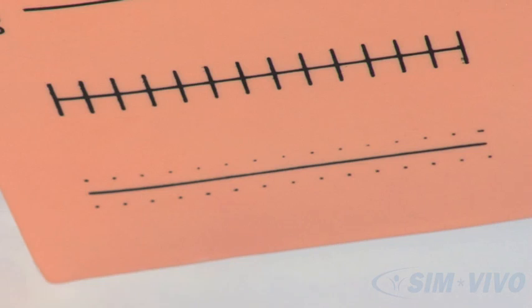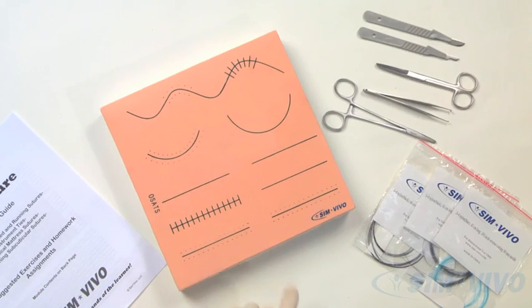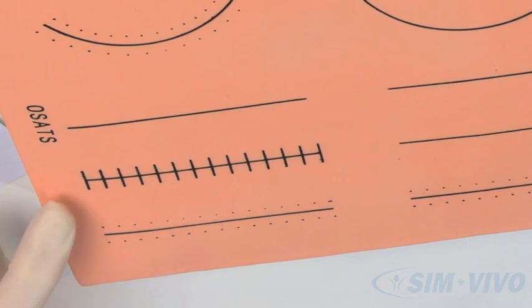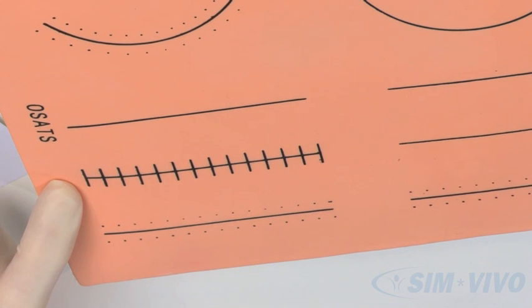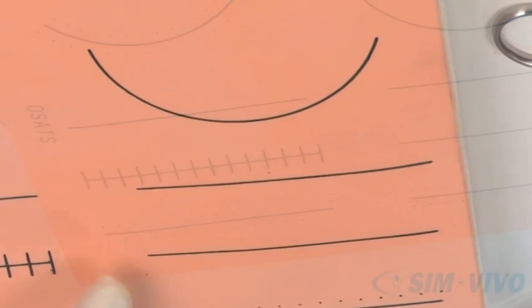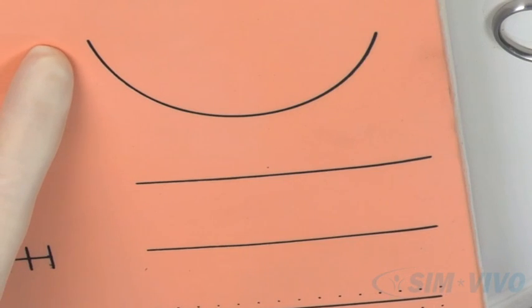Some of the lines have dots to direct the placement of simple sutures, and some of the lines have crosshatches that facilitate the practice of subcuticular suturing. The real challenge comes with the closure of the lines without markers.